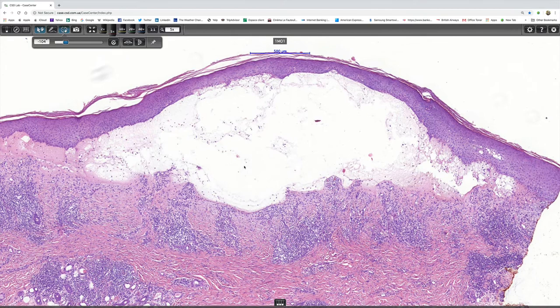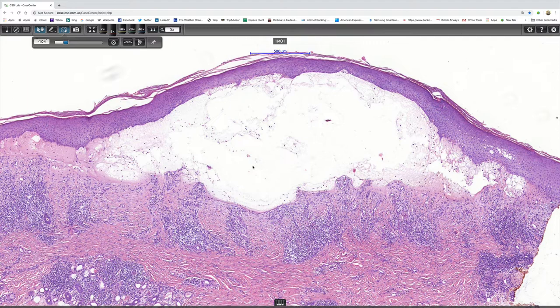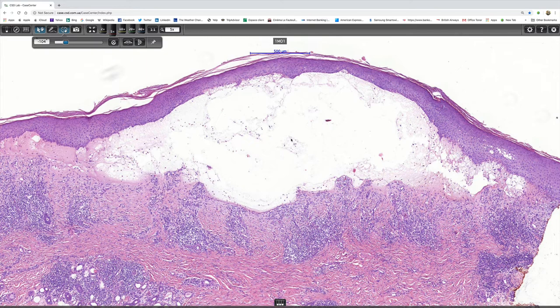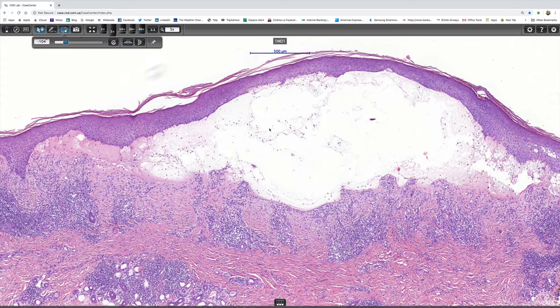In this particular instance this makes the diagnosis child's play, because bullous pemphigoid develops in the lamina lucida, which is the space between the cell membrane of the basal keratinocyte and the basement membrane composed of type 4 collagen. So the split in this blister is within the lamina lucida. You don't need any clever immunohistochemistry for basement membrane stains; you don't need to do a PAS. Even without immunofluorescence, the only diagnosis that's really tenable is bullous pemphigoid.